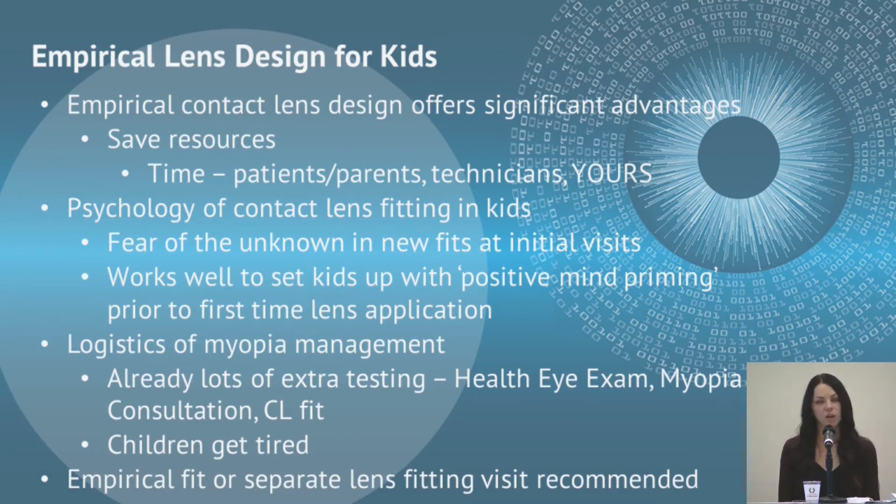And when it comes to our myopia practices, the patient experience is very, very important. Kids come in and they have only so much energy. The parents, there's a lot of time we need to spend discussing things in a myopia control clinic. And so empirical design has become a huge important part of our practice. And the cool thing that we're going to show you is a way that we can do this using the CRT lens in terms of empirical lens design just directly off of the ESP.